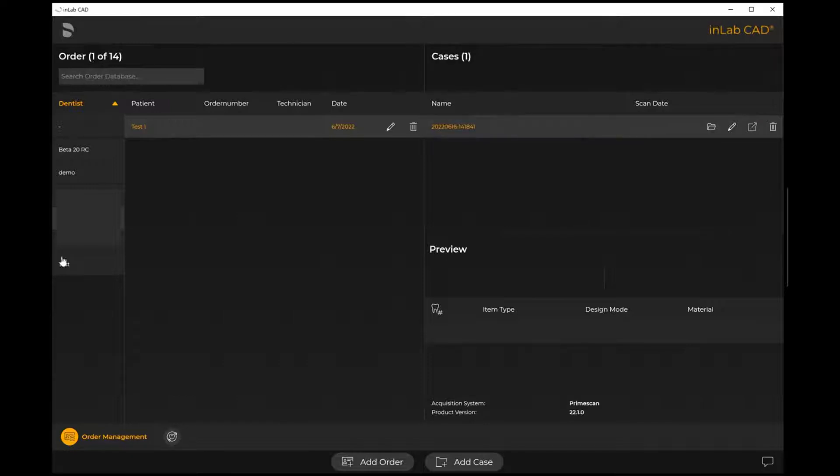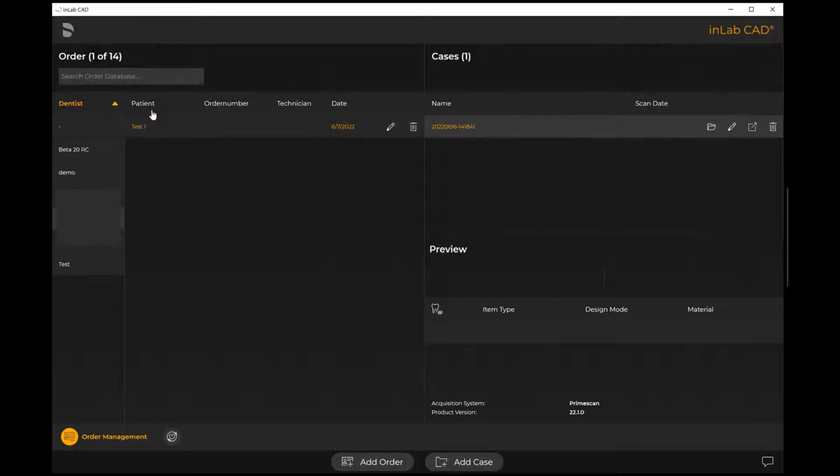This is the screen where you're able to see all of your dentist cases and your existing patient files.